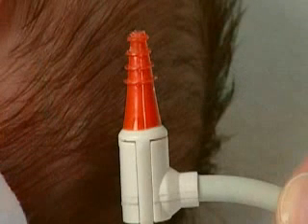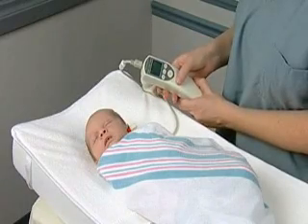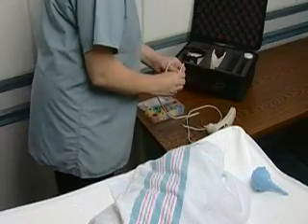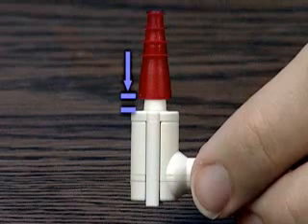When screening an infant with the external probe, the red-flanged ear tip is usually the best choice, because the tip makes a better seal in the ear canal when your hand is not there to assist. To begin testing a newborn, select an ear tip and place it as far down as possible on the probe tip. If there is any space between the probe tip and the ear tip, the test will not run correctly.